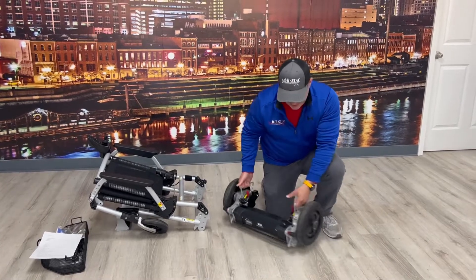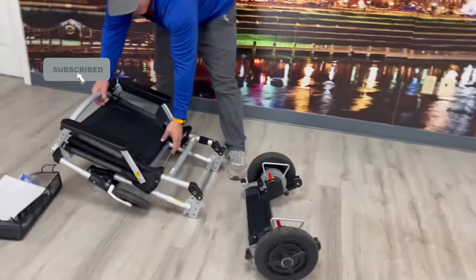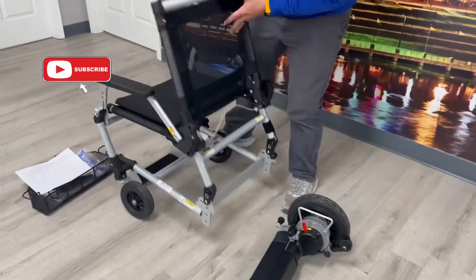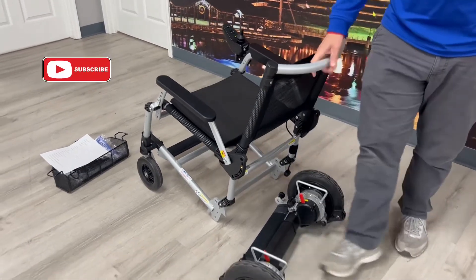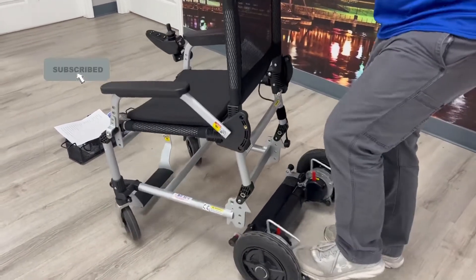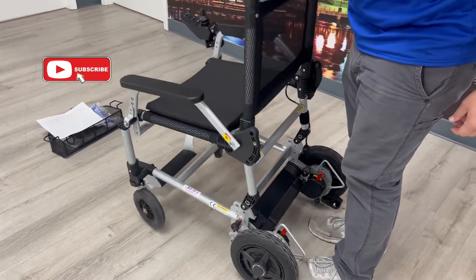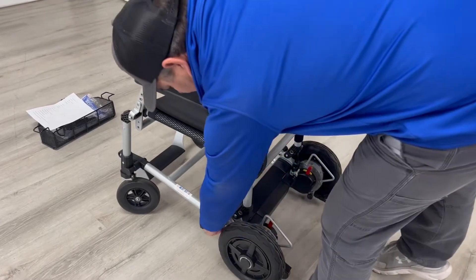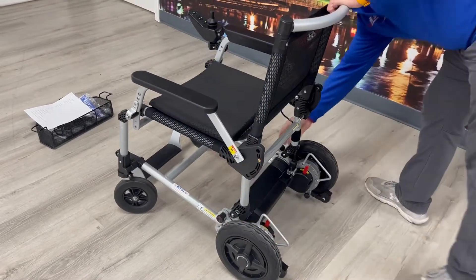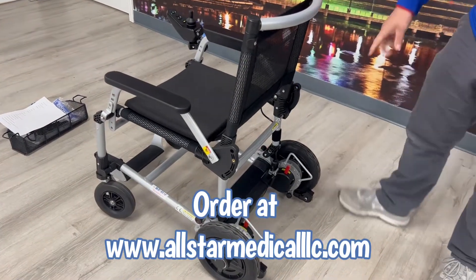You've got your anti-tippers on the back side. When you want to put it back together, you raise this up, open it up, then come right here, step on the anti-tipper portion, and slide that right in — and you're ready to go. Just put the lever back on here and you're ready to go.